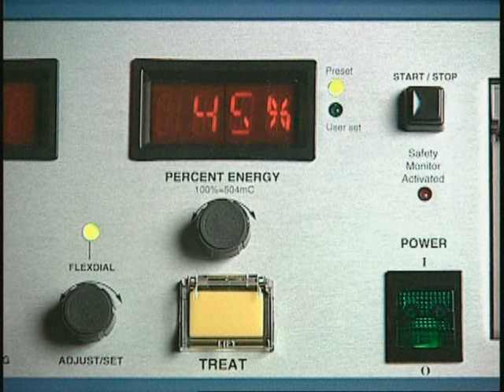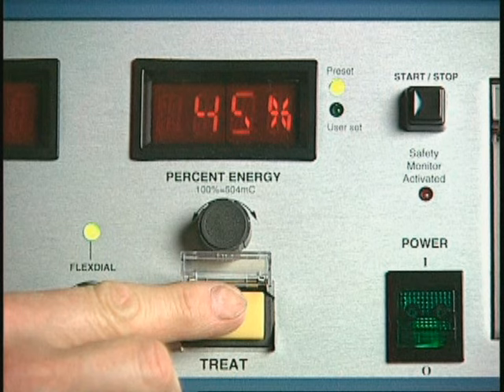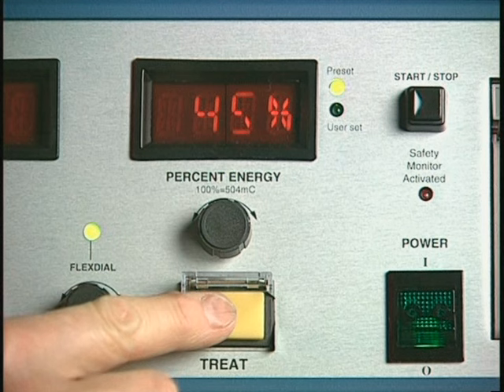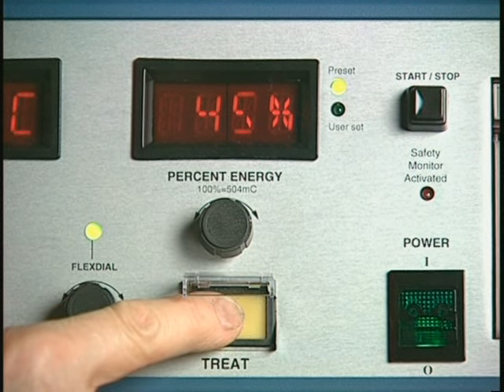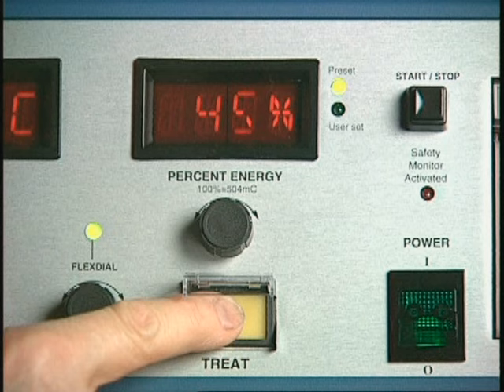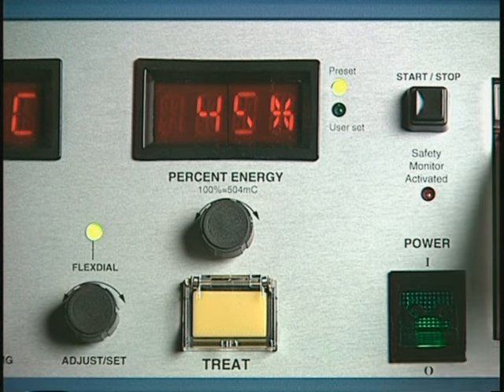To administer the treatment stimulus, flip up the clear plastic hinged cover over the Treat button. Press the Treat button and hold it down until the treatment light comes on and then goes off again. Releasing the Treat button before the Treat light goes off again will stop delivery of the remaining portion of the stimulus.